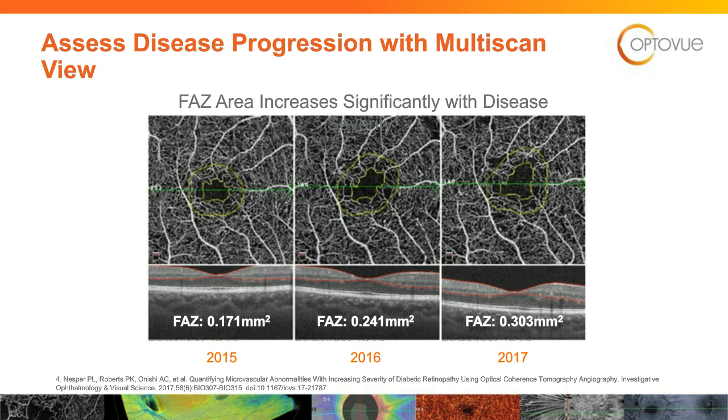Neo has to have a framework to grow. It's going to grow in the vitreous. It's going to grow on the surface of the retina and into the aspects of the vitreous. So you're going to be able to image that above the level of those capillary plexi. So that's how you're going to differentiate that, looking at your different scans. If the vessel is showing it being anomalous in the superficial or deep plexus, IRMA. If you're imaging it just above the superficial capillary plexus on the surface of the retina, that's much more likely neo.